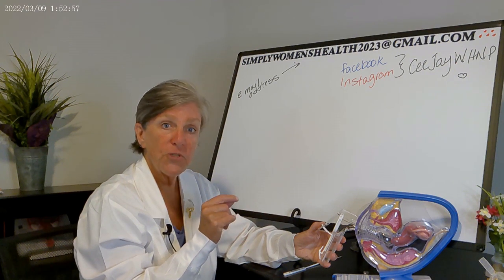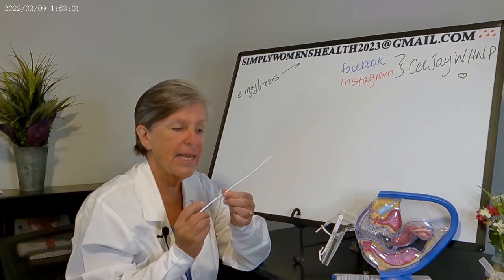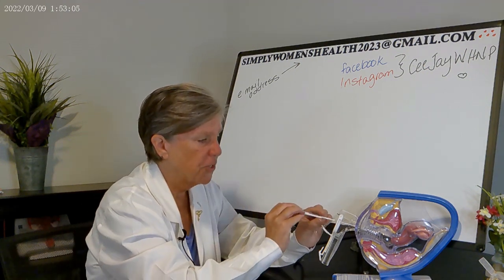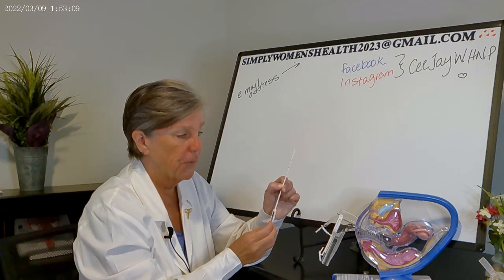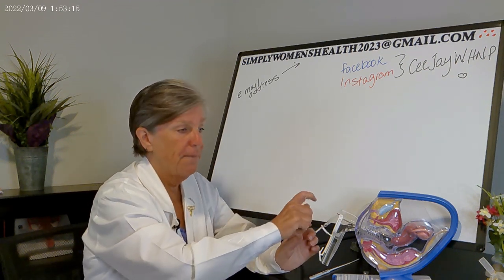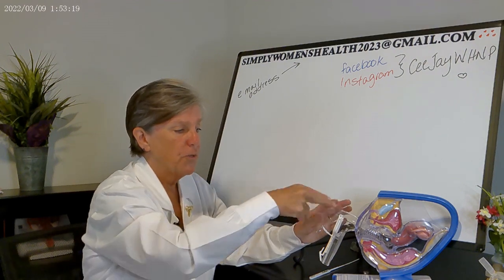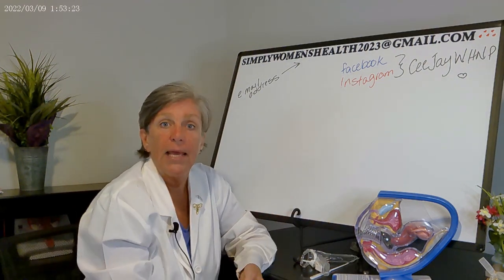After they clean off your cervix, your provider is going to put a sound. It looks like this, and it's got little measurement things in. They're going to go all the way up into your uterus, and they are going to see what is the depth of your uterus. Then they are going to get the IUD. They're going to get it out of the package. They're going to put it up in. They're going to pull out the applicator, trim the strings, take the speculum out, and call it a day.